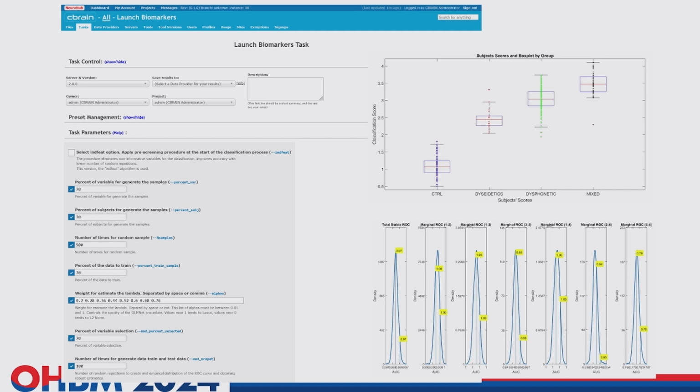It was more or less the same age range as the previous Cuban Normative Database, and that's why I say that we were able to compare the power of our old database with the new one. But besides this, we also incorporated the new features that the harmonized qEEG has.